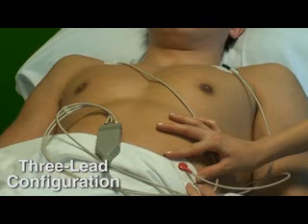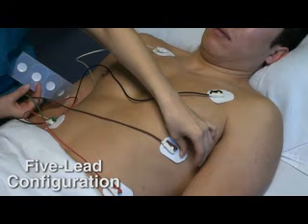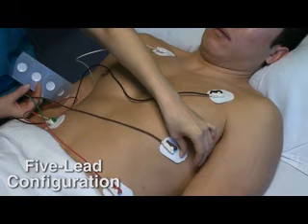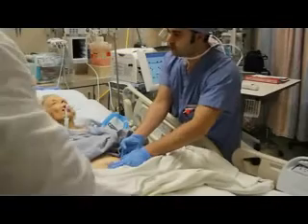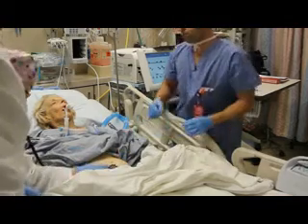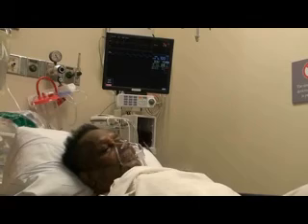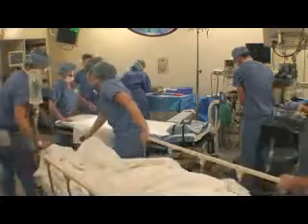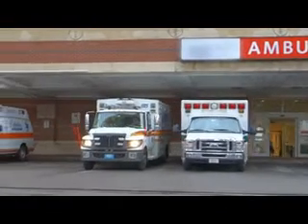This video focuses on 3-lead and 5-lead configurations, which are commonly used in real-time ECG monitoring. ECG monitoring is used in many clinical settings, including intensive care units, intermediate care units, operating rooms, emergency departments, and ambulances.